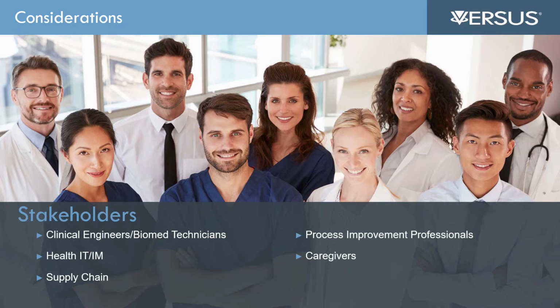If you're looking at managing IV pumps throughout a facility, they're the ones that are going to be starting those medications, starting those IVs. You want to include them at certain points in the project, because I think really what you can have is a cultural impact in your organization. I think you can move and change the culture in such a way that instead of having folks that hoard equipment, you can build a level of trust such that they will know and believe that there's equipment ready when they need it.